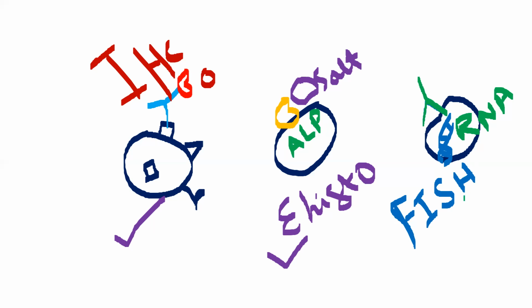In FISH, in situ hybridization, we are detecting the DNA or RNA with the help of some molecular probes. Here, rather than saying antibodies, we will say probes. We will have specific probes that bind to either DNA or RNA, and these probes are conjugated with some enzymes, radioisotopes, or fluorescing components, and those fluorescing components will give us color. These are the three major branches of advanced histochemistry.